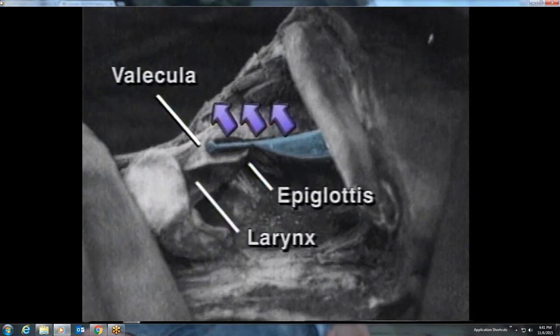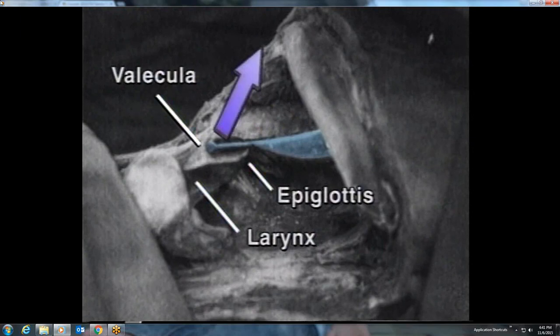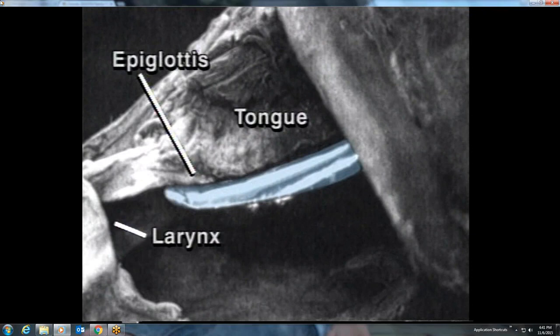Traction on the laryngoscope in the direction of the handle causes elevation of the epiglottis when the tip is correctly placed. Levering backwards on the handle of the laryngoscope can not only cause damage to the teeth, but also worsens the exposure of the larynx, because the tip of the curved blade is then not correctly applied to the vallecula. With the straight blade, the larynx is exposed by directly lifting the epiglottis.